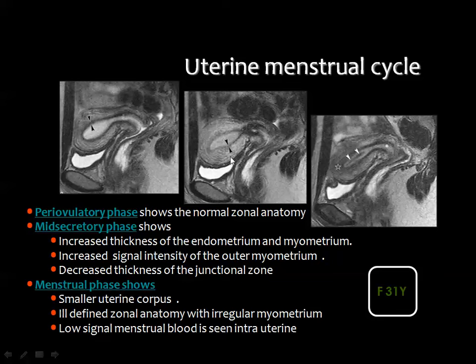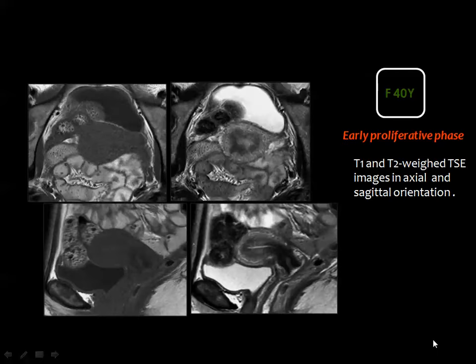In the mid-secretory phase there is appreciable thickening of the myometrium, relative distension of the uterine cavity, and thinning of the junctional zone. In the menstrual phase, blood clots are visible inside the uterine cavity. In T1-weighted images you only see the shadow of the uterus without zonal anatomy detail, whereas in T2-weighted axial and sagittal images the zonal anatomy is clearly visible.